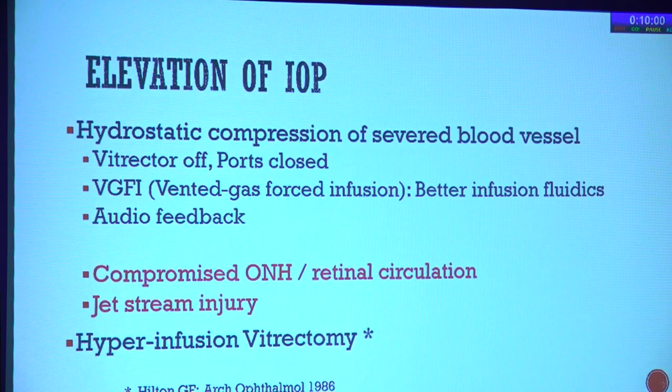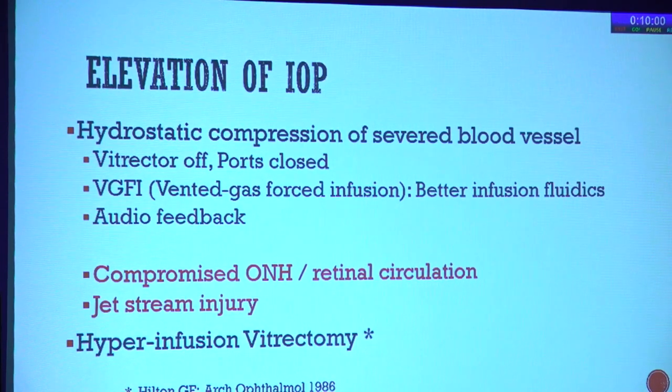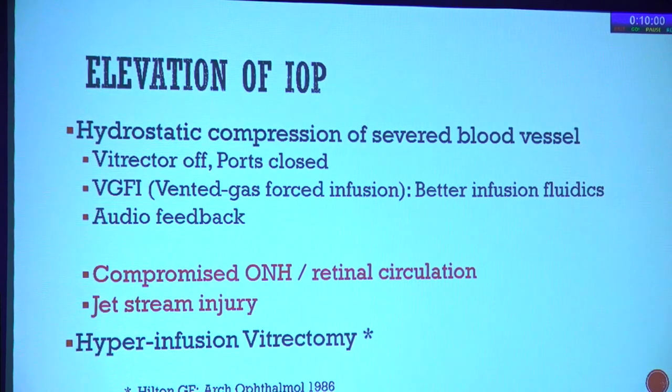Ports have to be closed, and if there is a mismatch of the ports or leaking valve cannulas, make sure that the cannulas are plugged. And it is always better to have an audio feedback. Some machines don't give you the time that the tamponade is kept on, and that can cause ischemic damage, which is sometimes irreversible. So the compromised optic nerve head and retinal circulation is the main concern here.